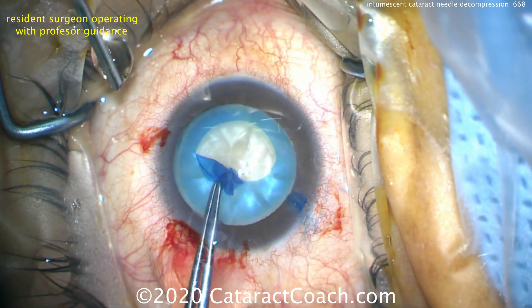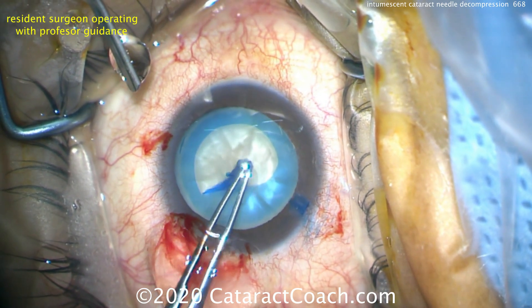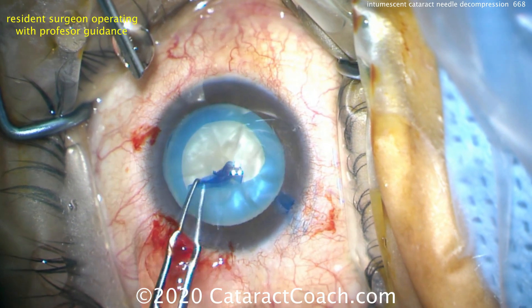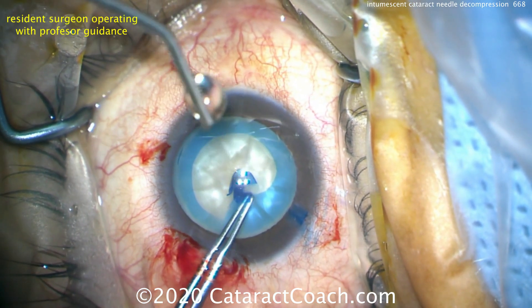Here the resident is doing a beautiful job of creating a round capsulorhexis — very nice, beautifully centered, appropriate size. This case is going to go great. Definitely keep all these techniques in mind.